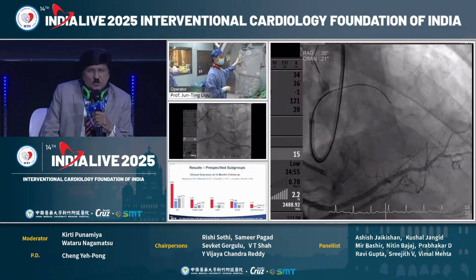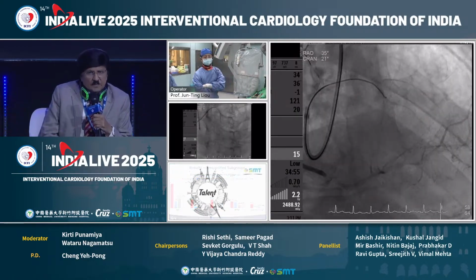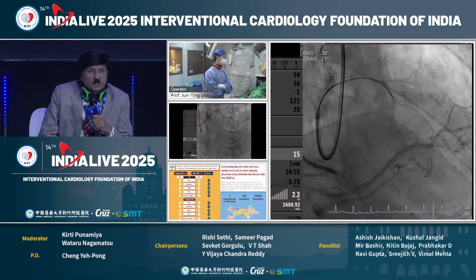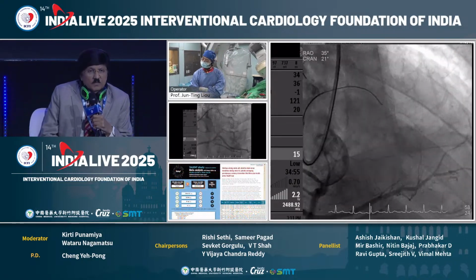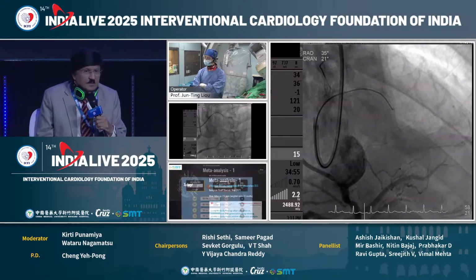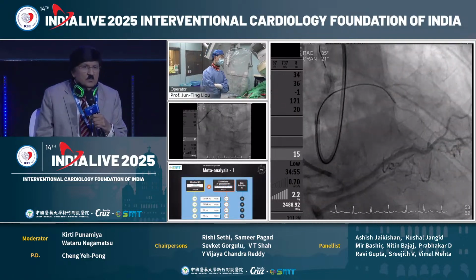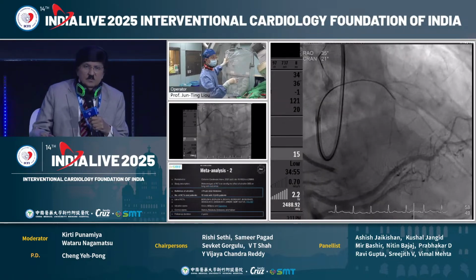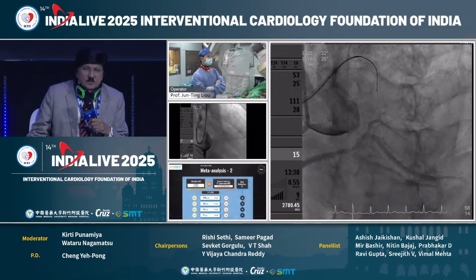So do you have a Recross catheter over there, a double lumen catheter? Yes, we have a lumen catheter. We have Sasuke. Recross? No, we don't have Recross. We have Crusade and Sasuke microcatheters. We can see the lateral view. Can we see the lateral view?